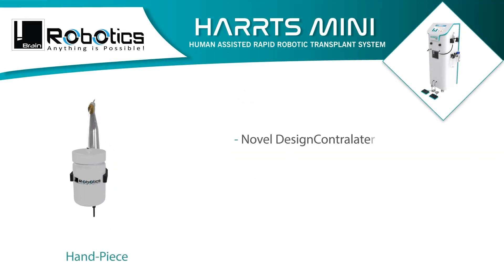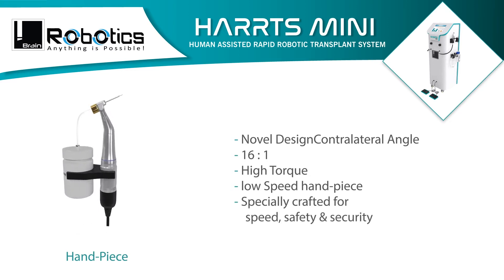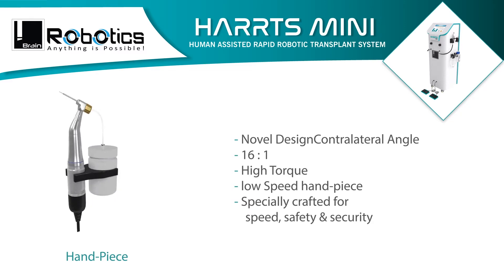Novel design with a contralateral angle and a 16-to-1 ratio. High torque, low speed handpiece specially crafted for speed, safety, and security.